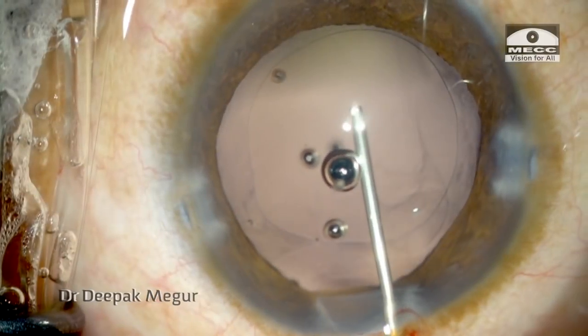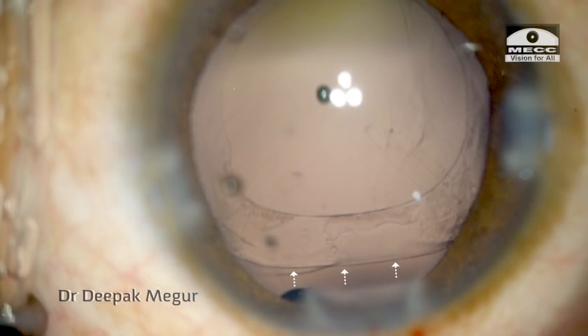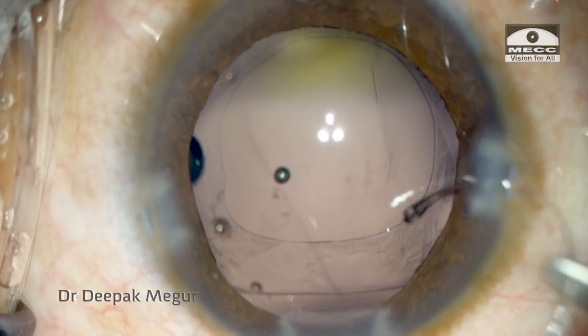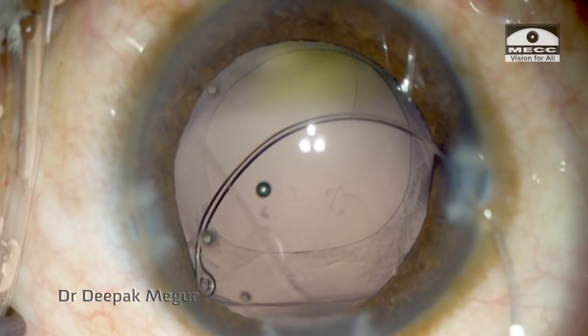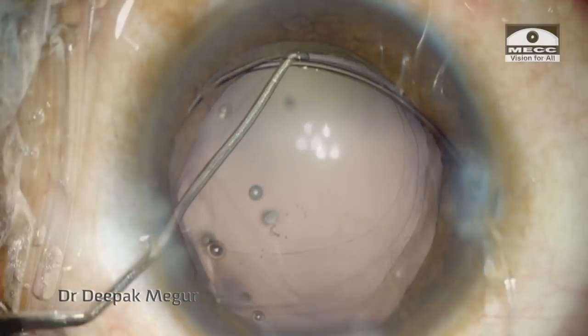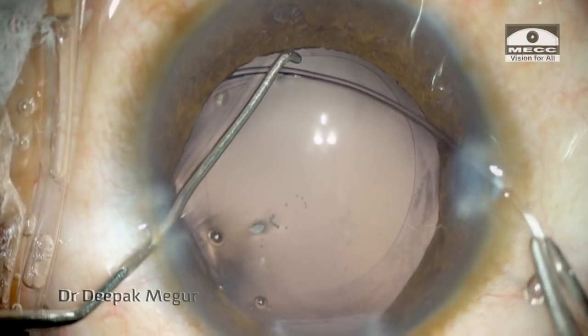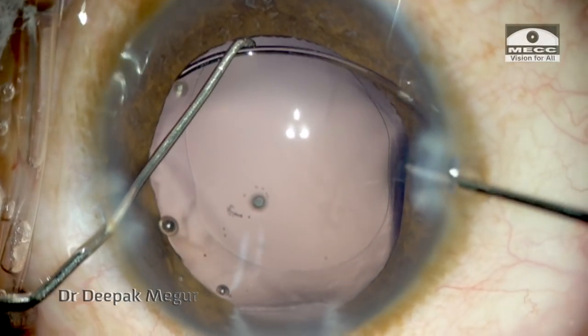Another case where we can see a localized area of zonular dehiscence — again the classical D-shaped bag is present. Once after filling the bag with OVD, I am gently dialing the CTR using the bi-manual technique. I find that the bi-manual technique of introducing the CTR is extremely accurate and also least stressful on the zonules.